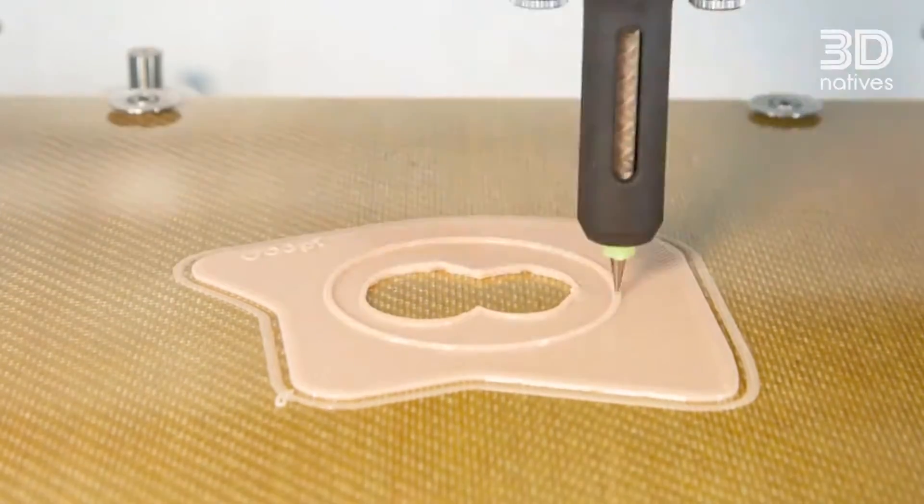Right now, we are using biocompatible silicone and we are printing this in liquid deposition modeling.